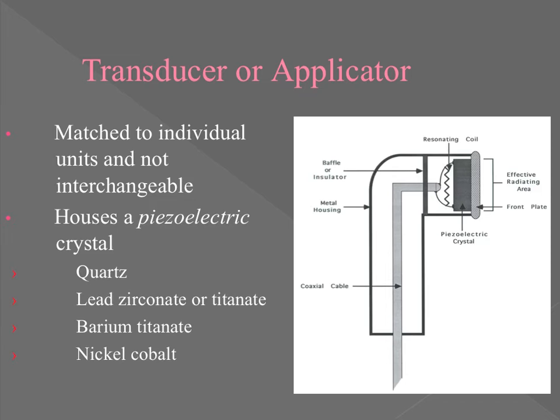And so most units, it's not interchangeable, but your textbook says this, but I'm telling you, you certainly can swap them out by plugging them in. So the newer units do allow for you to change the size of the actual head itself.